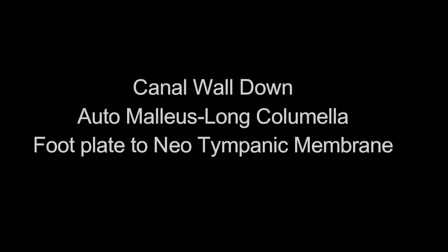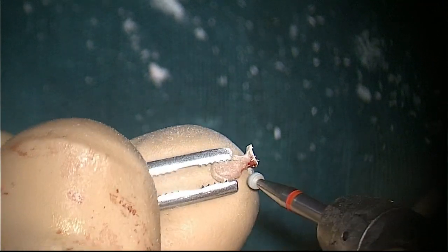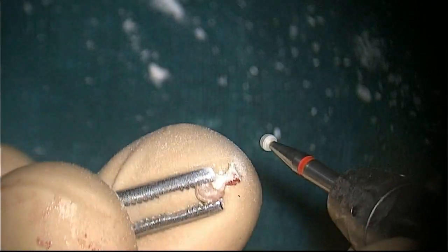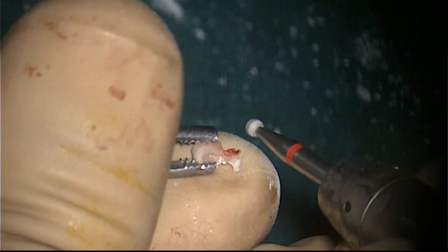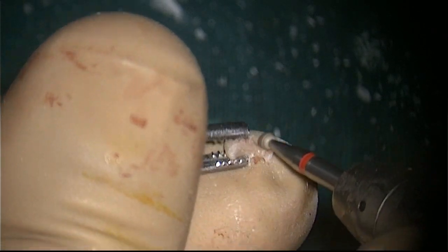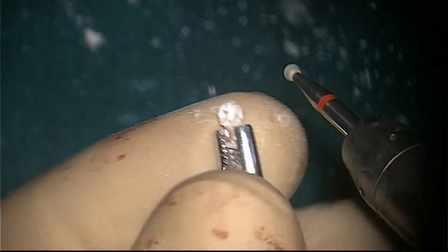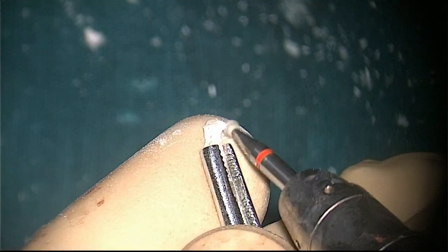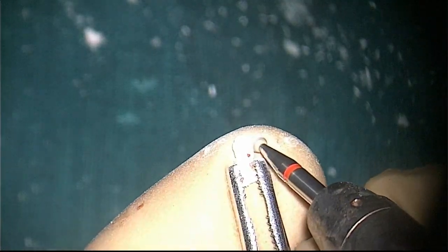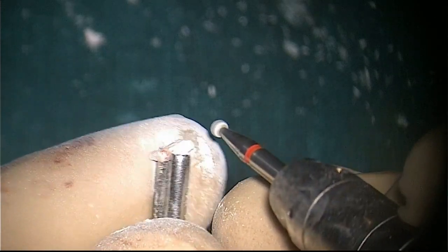And in canal wall down technique, you can see I have taken the patient's own malleus, and it is sculptured in this way. The way you sculpture it is boot shaped. You can see just below the short process I made this one, and you can see the malleus is actually a curved bone which you can make straight also this way, because with a curved bone it is very difficult to make it sit on the footplate to neotympanum.